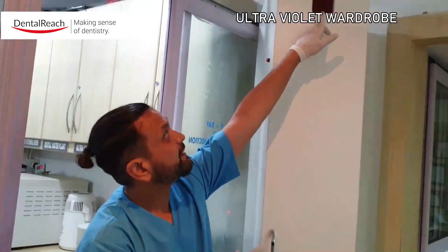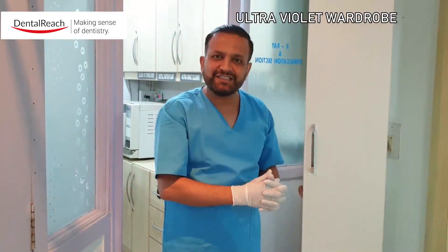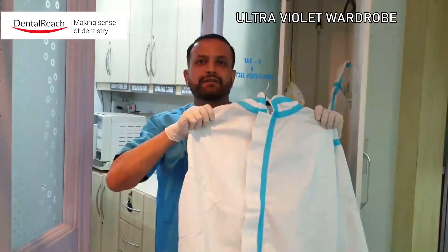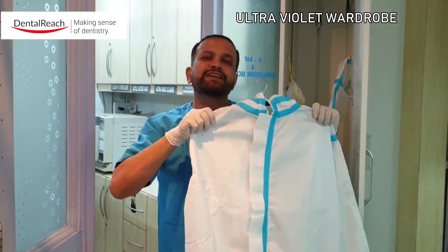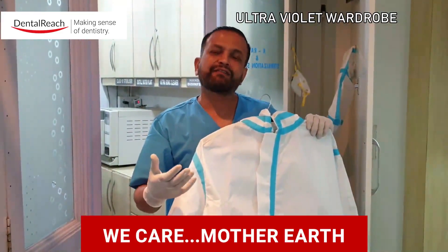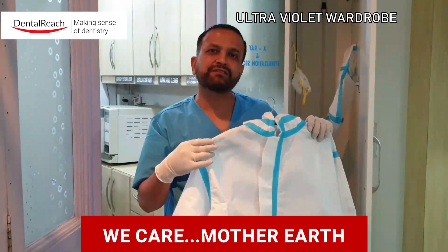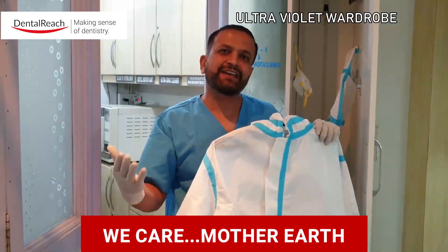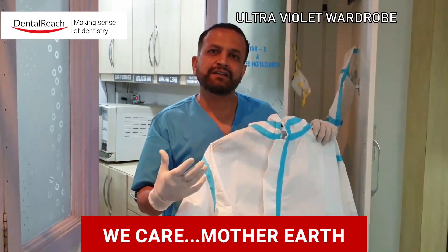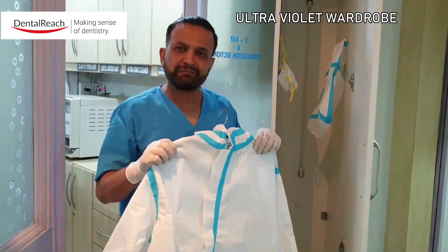Then I switch on the UV wardrobe — when switched on you can see that the light is on. Leave it overnight and come back the next day to switch it off. This is how we maximize the use of PPE for better utility and to make sure that we do not discard PPEs and create a hazard for the environment. This is the idea of reusing PPEs. Thank you very much for your patient hearing — really appreciate it.